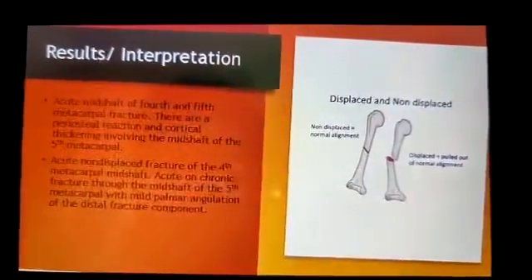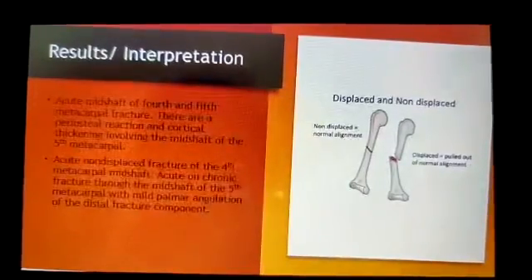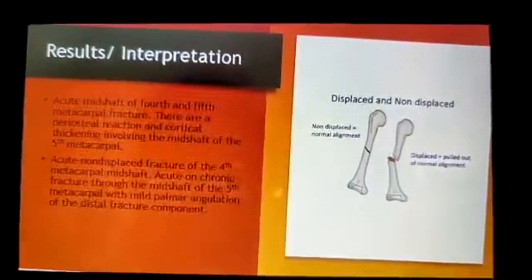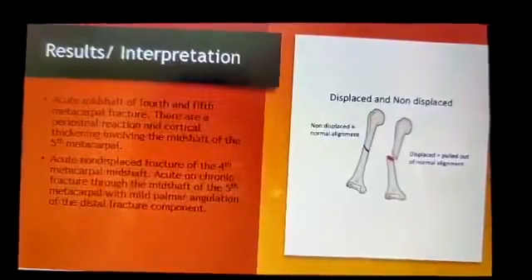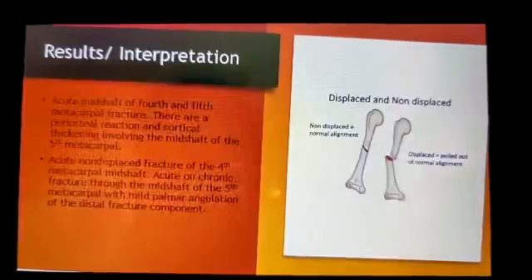Acute non-displaced fracture of the fourth metacarpal midshaft. Acute on chronic fracture through the midshaft of the fifth metacarpal with mild palmar angulation of the distal fracture component.